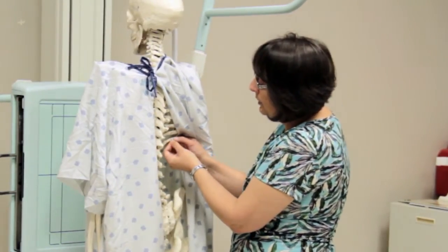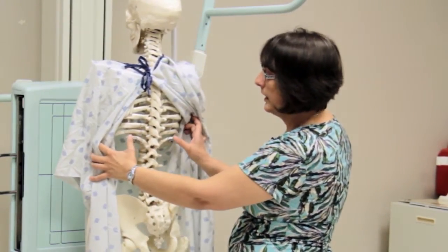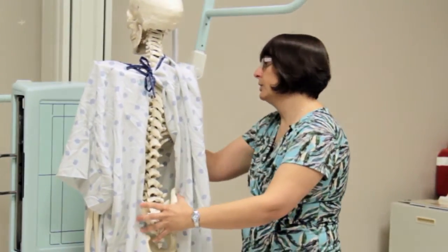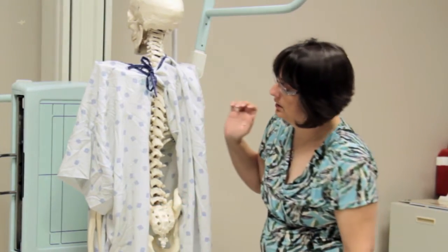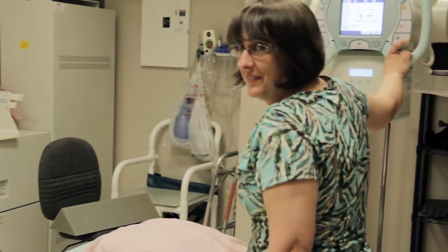For our patient here, we're going to put them either side of the spine. We're going to do this PA, which is your normal protocol. The next step is to set up the tube.